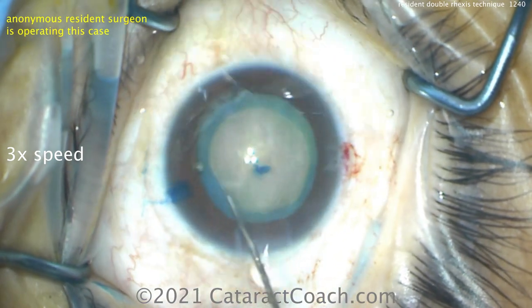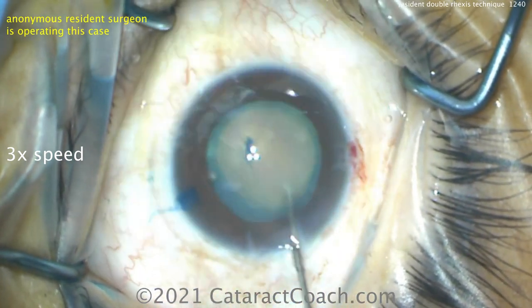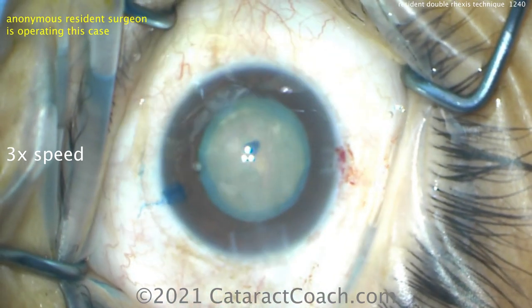So hydrodissection — be cautious because you can't see the fluid wave going across, so just a little bit at a time. And there the nucleus rotates just fine.